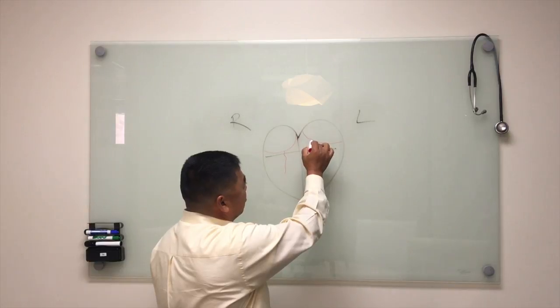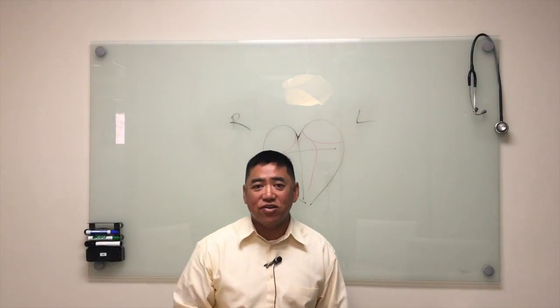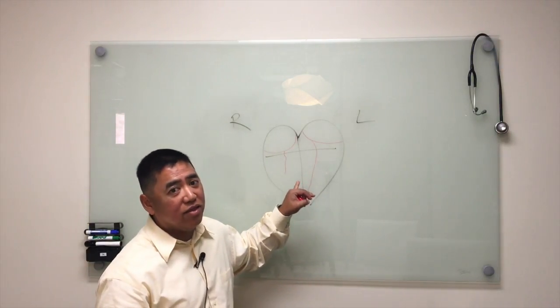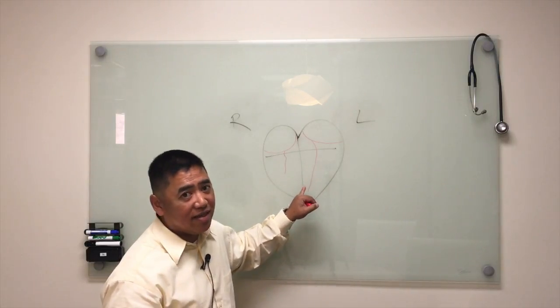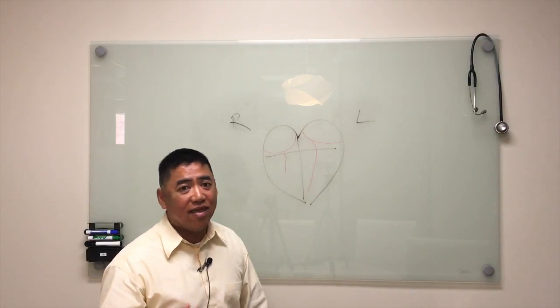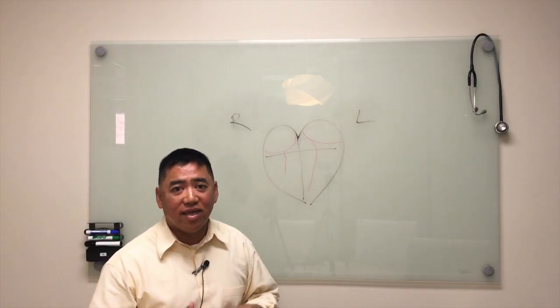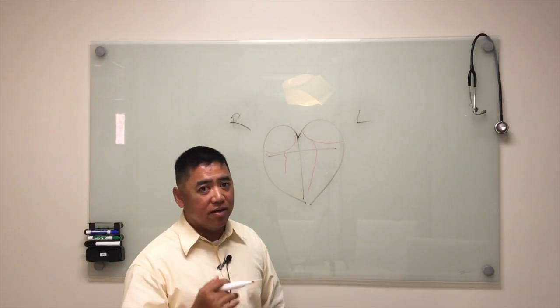It also has a branch that comes down here, and this is what's called the left anterior descending. Now this right here is what's called the Widowmaker. A severe blockage in this area can result in death, and so when you're looking at your scan, that's exactly where you want the most minimal amount of calcium deposits.